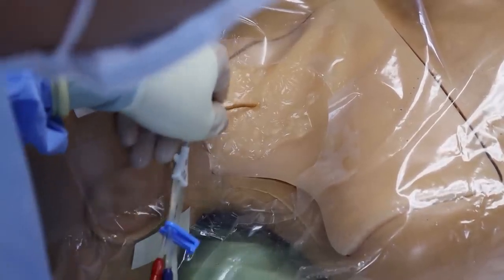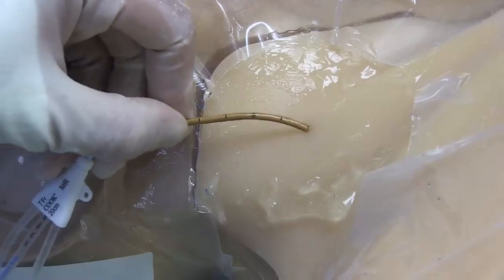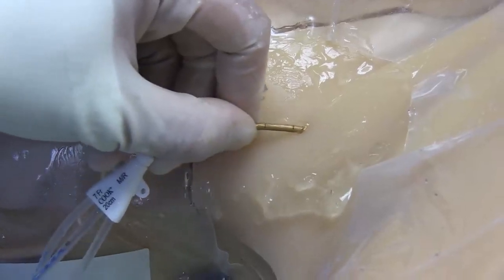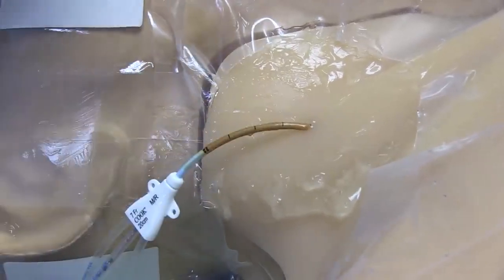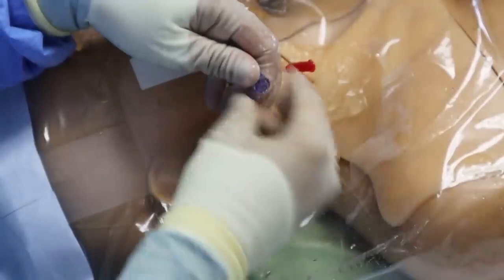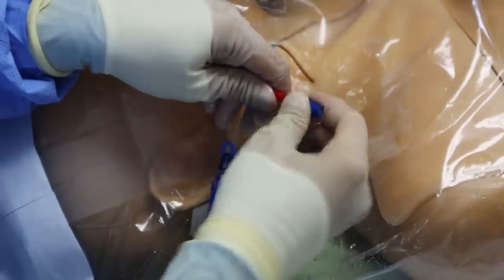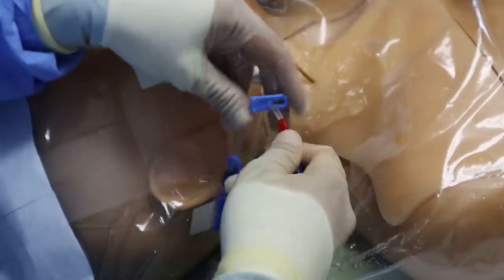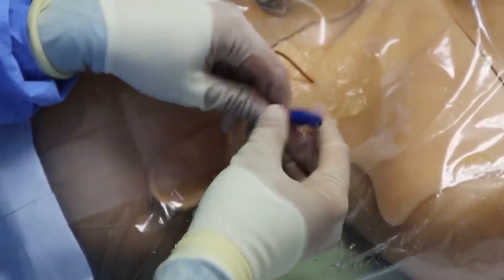In a right-sided IJ, I typically insert to about 16 cm. If you stick around, I will discuss appropriate insertion depths for the other sites. Remember you left the middle port without a blue cap so the wire could poke through? Well, now you'll want to place that last blue cap onto the middle port.